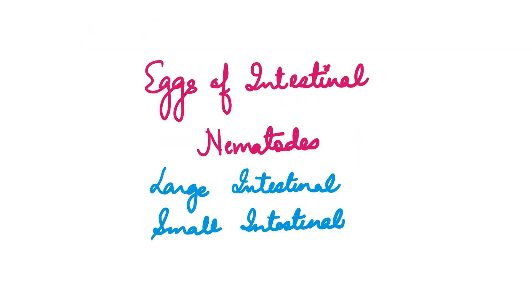Next we move on to the eggs of intestinal nematodes — we're going to study the large intestinal nematodes, Enterobius vermicularis and Trichuris trichiura, and small intestinal nematode eggs like Ascaris, the hookworms, and Strongyloides. Let's start with Ascaris lumbricoides, the longest roundworm found in the human intestines.